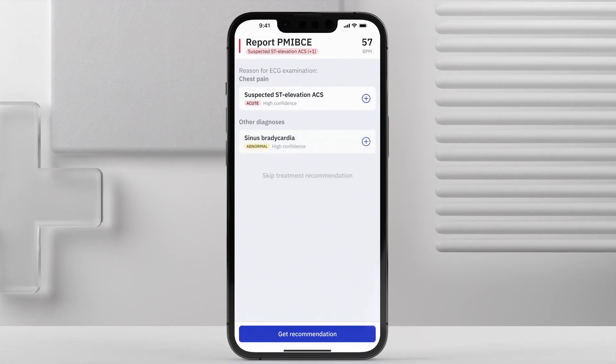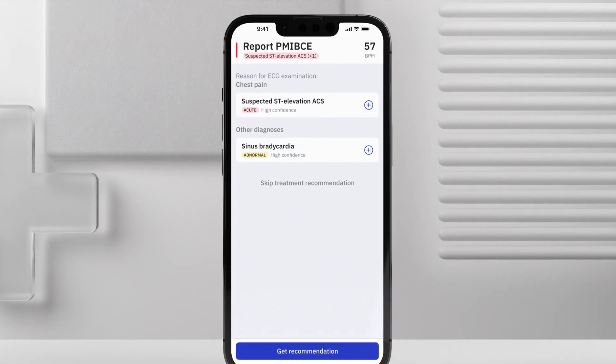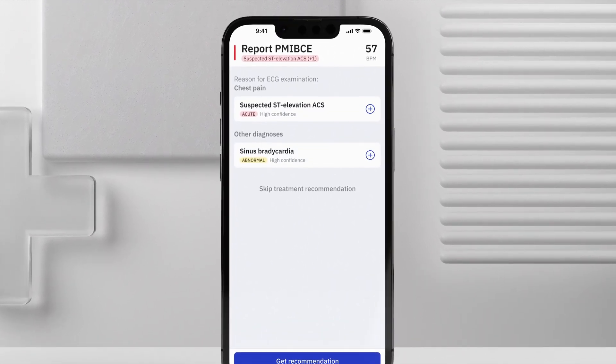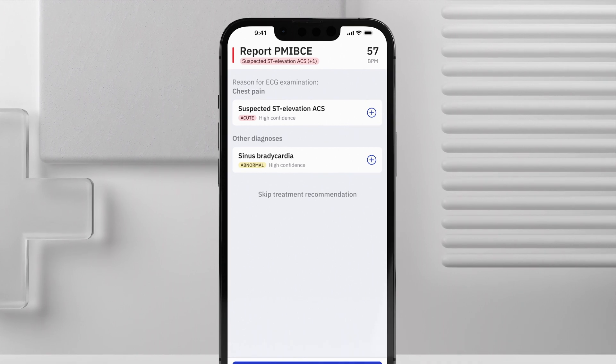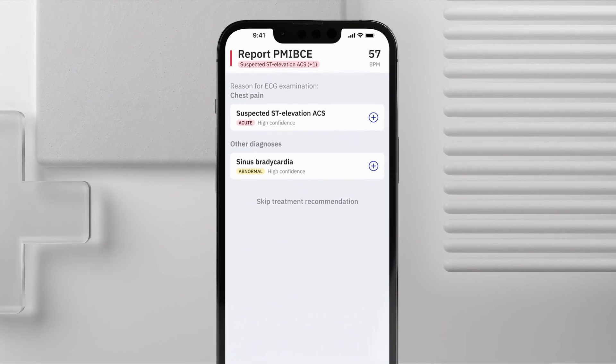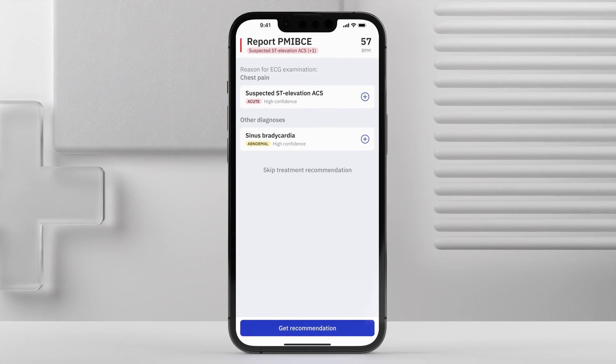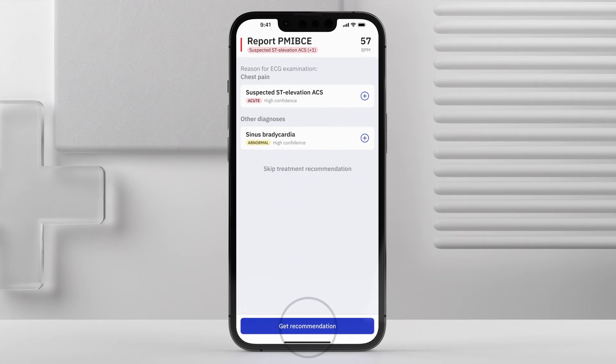Our AI algorithms detect 38 cardiovascular diseases. For more in-depth and disease-specific treatment suggestions, tap Get Recommendation.